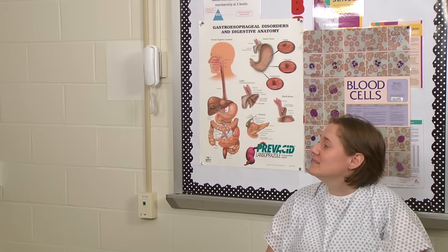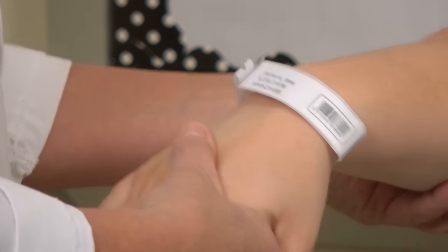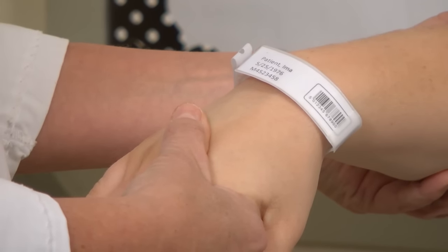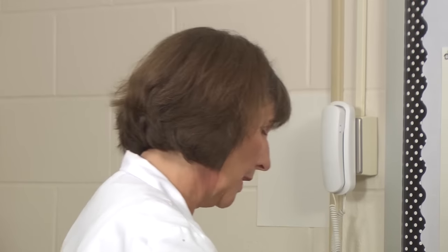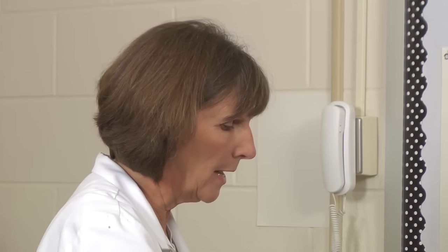Alright, Mrs. Patient, here I come. Hi Mrs. Patient, I'm Tracy. I'm going to be your nurse today. Can I check your ID band? And can you tell me your name and date of birth? The doctor has ordered an IV on you, so are you right-handed or left-handed? Right-handed. Okay, I'm going to look in your left hand. Usually I like to put an IV in the non-dominant hand — that way it's a little bit easier when you're eating or drinking.